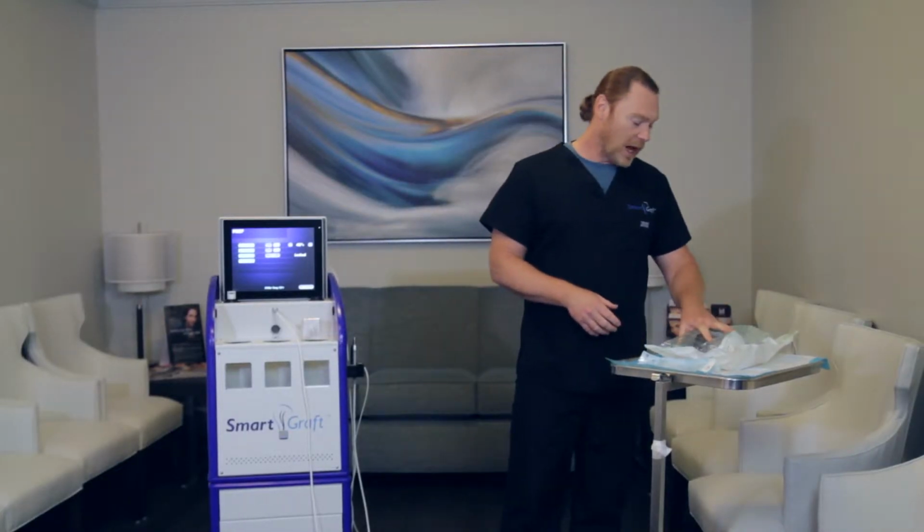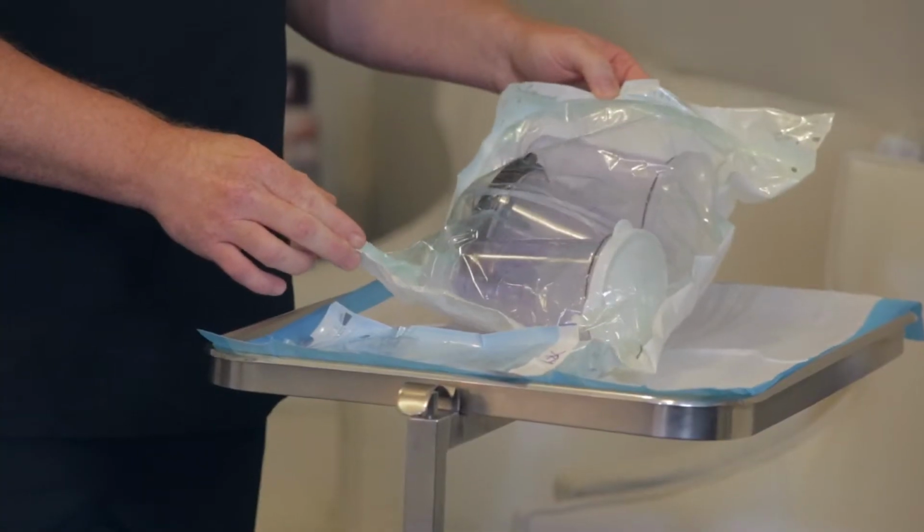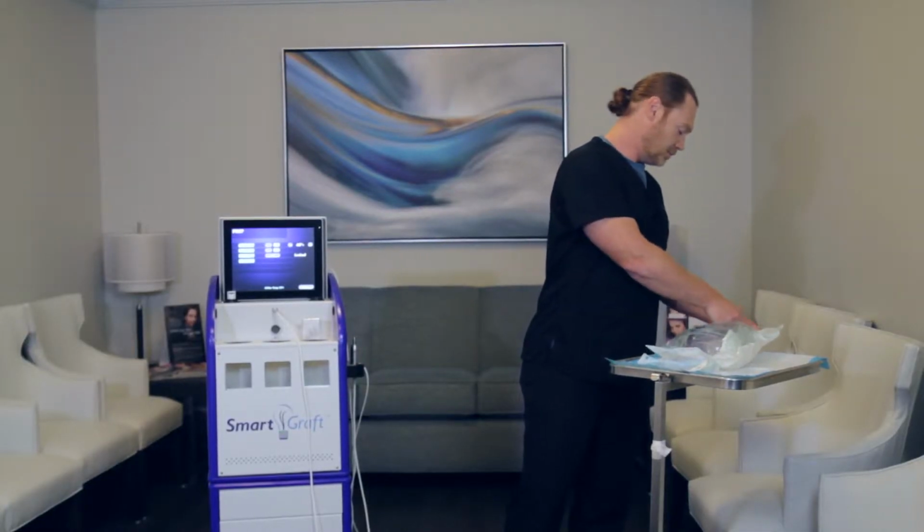Today I'm just going to go over the setup of the SmartGraft device itself and all the functionality that it includes. Over here you have disposable packs. They are autoclaved, just as in the pack itself. So first thing you want to do is open this up.